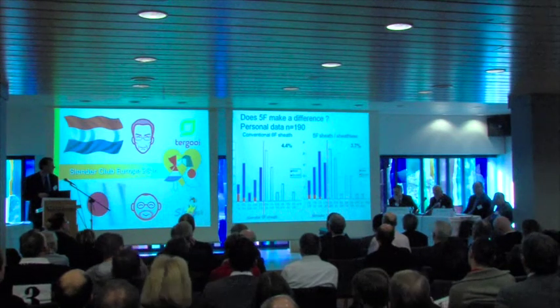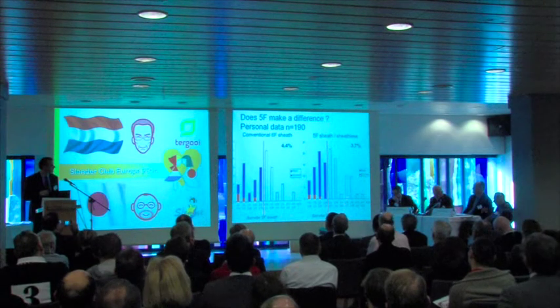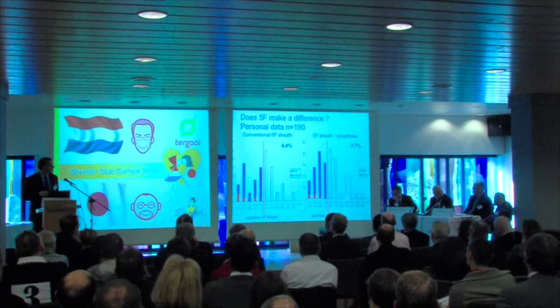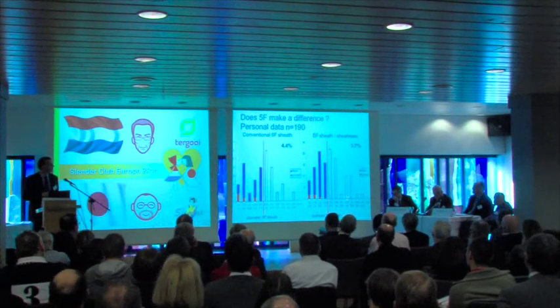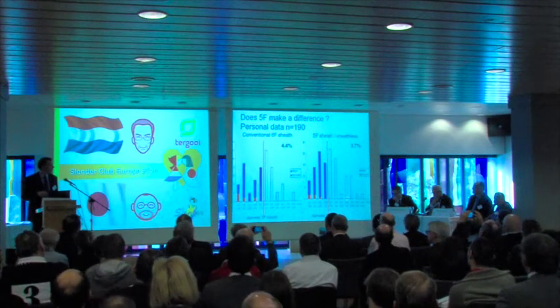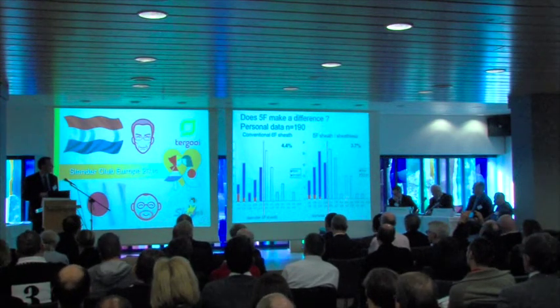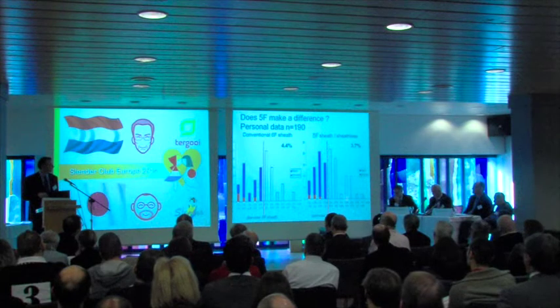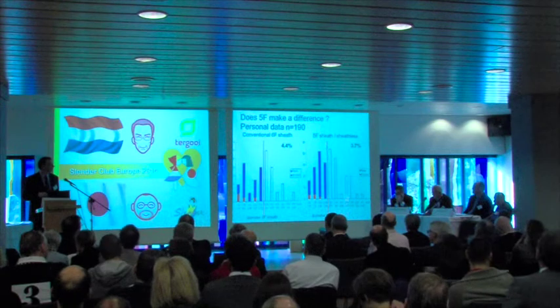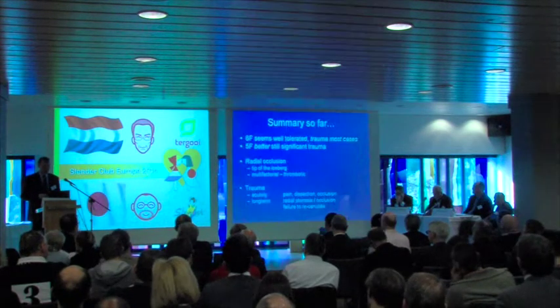This is some of our data comparing a sheathless approach, which essentially involved a 5 French sheath, so it was a 5 French approach, comparing that with 6 French. And we didn't get as much of a reduction in radial occlusion as we hoped. And I would try to persuade you that that's because even 5 French systems are still too big, when we're getting occlusion of these radial arteries that are still a lot smaller than our 5 French systems.